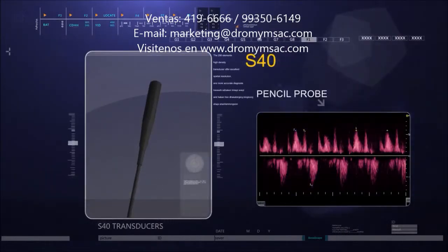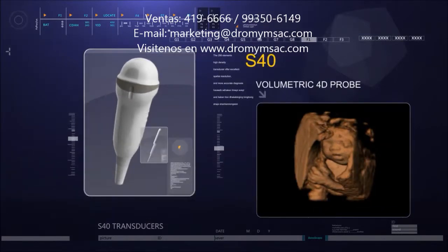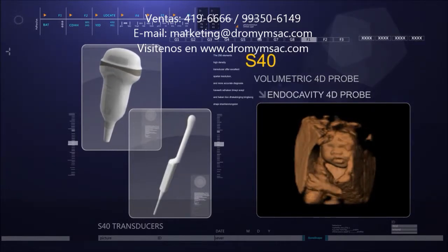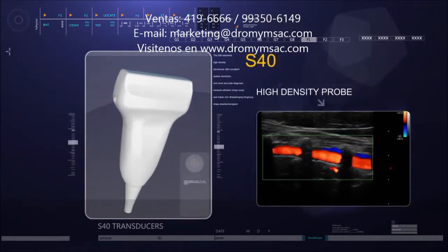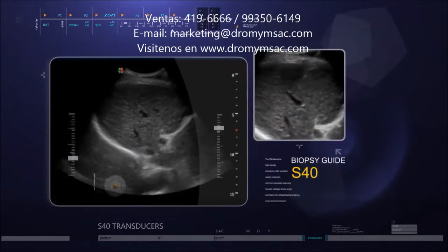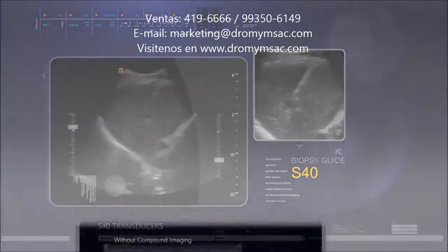The pencil probe is designed for cardiac and cranio-cerebral examination, able to get CW spectrum images in a short time. S40 supports traditional 4D probe and even transvaginal 4D probe, conducive to detection of fetal development as well as the condition of gestational sac and corpus luteum. The 256-element high-density transducer offers excellent spatial resolution and more accurate diagnosis. A biopsy guide allows doctors to easily locate the lesion and conduct penetration during surgery.